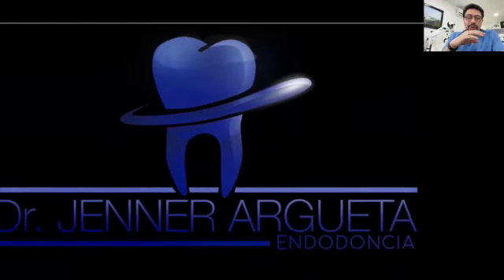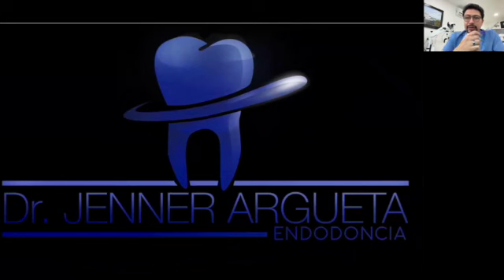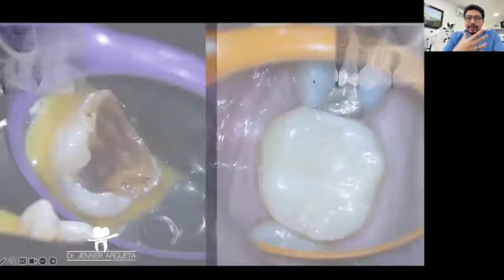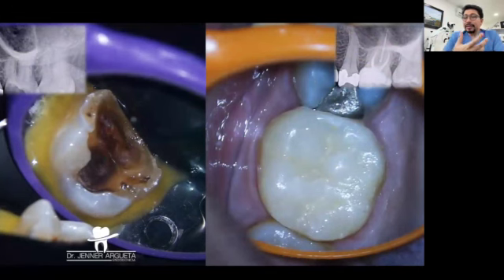We are trying to do some incrustations, overlays, inlays, trying to maintain as much as possible healthy dental structure. And we were able to work with that patient, and we were able to take her from a clinical situation like the one that you are seeing on the left side of the screen to a clinical situation in which you can see a restored tooth that has been in the mouth already for 6 years, and it's working perfectly.